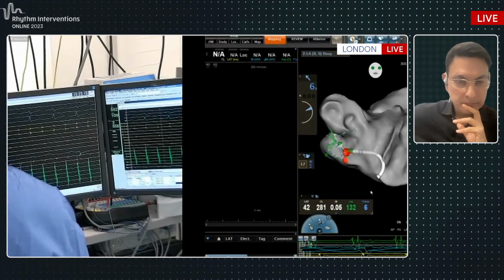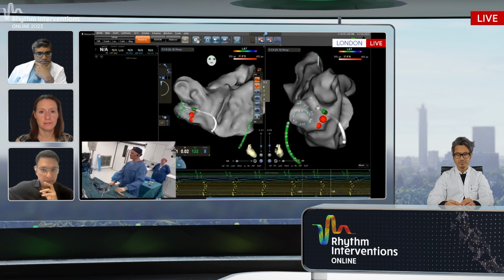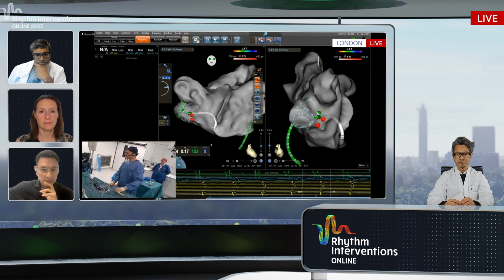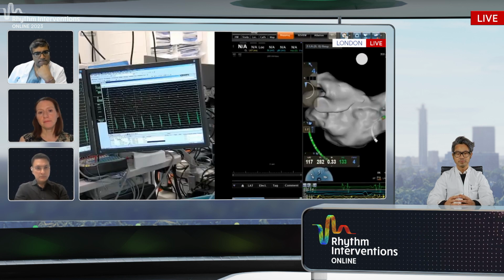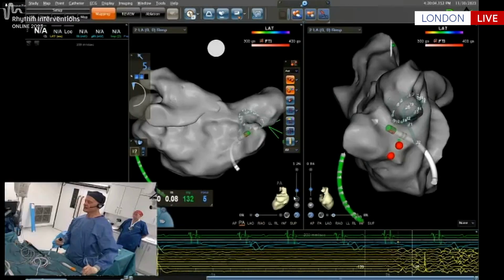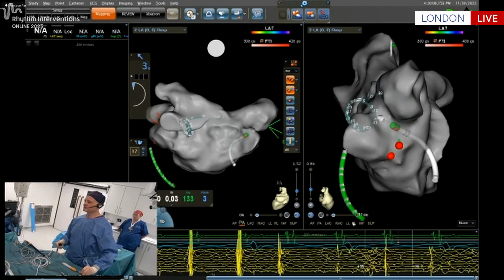Is it 2 mil Visitags, please, guys? Because I think we're on 3. So my preferred is 2, thanks. So nothing's happened there. And I'm going to come back to this in a minute, rather than get bogged down with this. And let's have a look at the tachycardia. Go PA, please. Before I do, I just want to show you the right upper is silent. The left lower is silent.